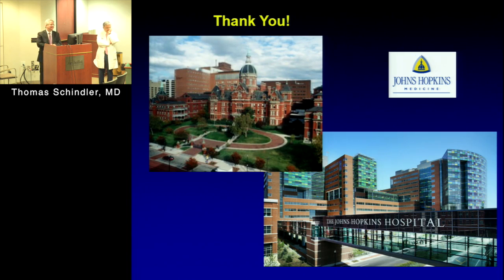So myocardial blood flow, using PET for myocardial blood flow and reserve signaling, even using C11 compounds, which would require an on-site cyclotron because of the short half-life, but no metabolic tracking. Of course, as an endocrinologist, that could also lead to different metabolic therapies, personalized, individualized therapies too. I don't know if you have any experience in that, tracking, using carbon-labeled compounds.